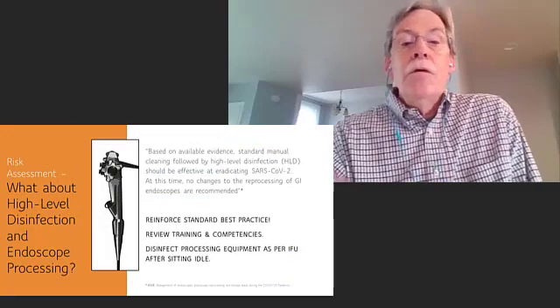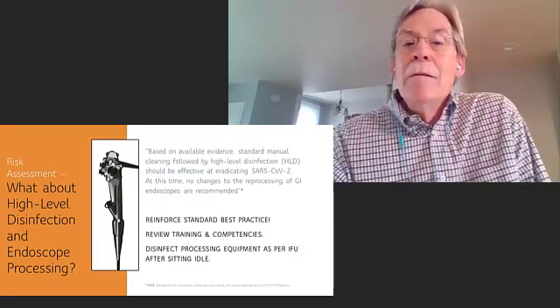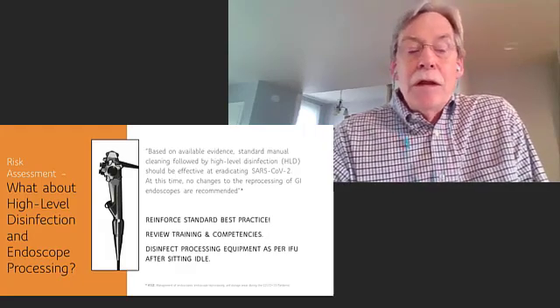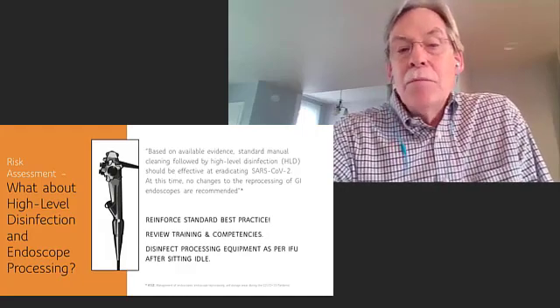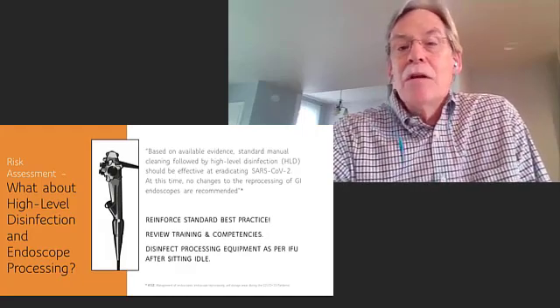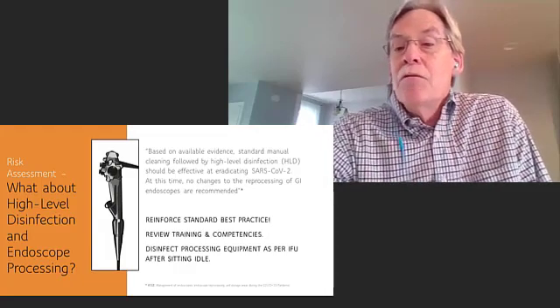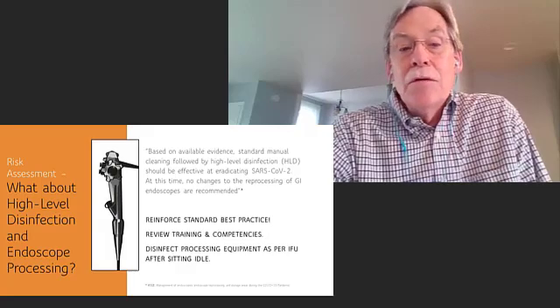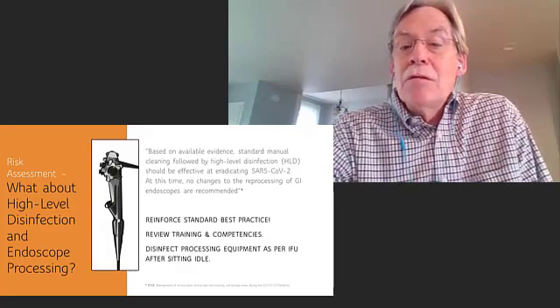Thanks, Seth. So as Seth was just talking about cleaning and disinfection processes, let's just take a minute to specifically speak to high-level disinfection and endoscope processing. So understandably, amidst all that we're dealing with, people are questioning any and all existing processes. This has run the gamut from who should wear what type of face mask to whether existing processing is effective against coronavirus. So the good news is, for the most part, standard best practices is what is needed.